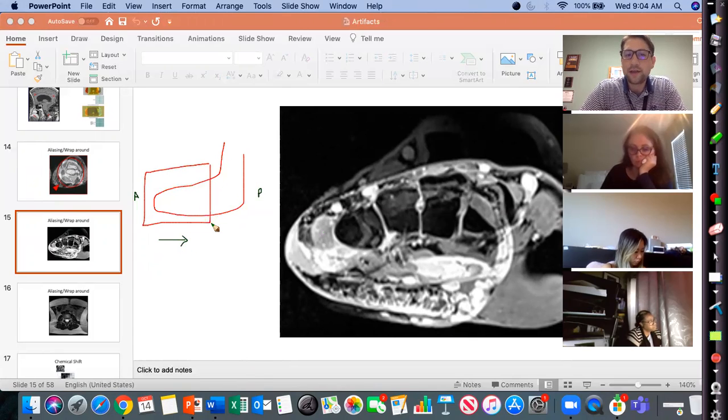So when you turn on that oversampling, let's say we give 25%. It's always 25% of the field of view, okay? So imagine that field of view is 100%, 25% would look something, I'm not being exact, but something like this, okay? And we always get it on both sides, so it would be something like this.